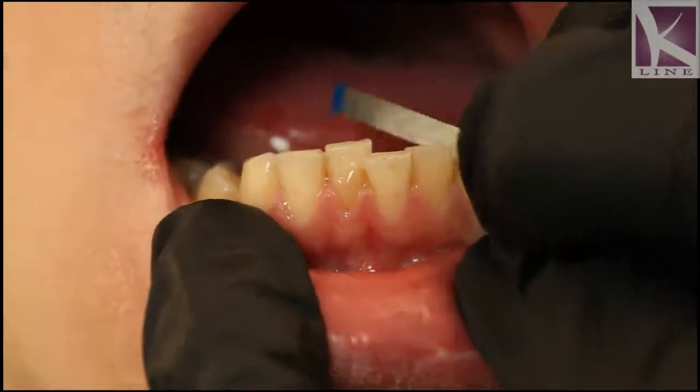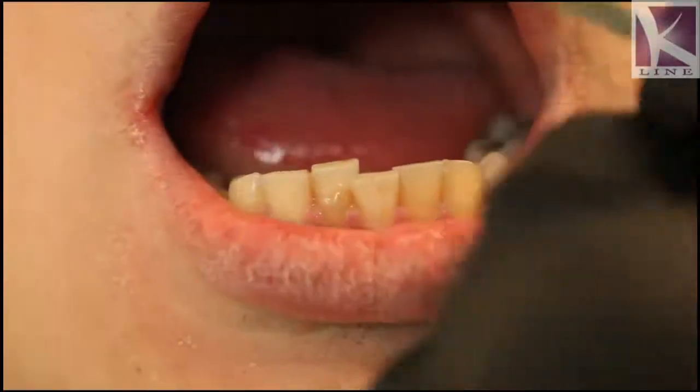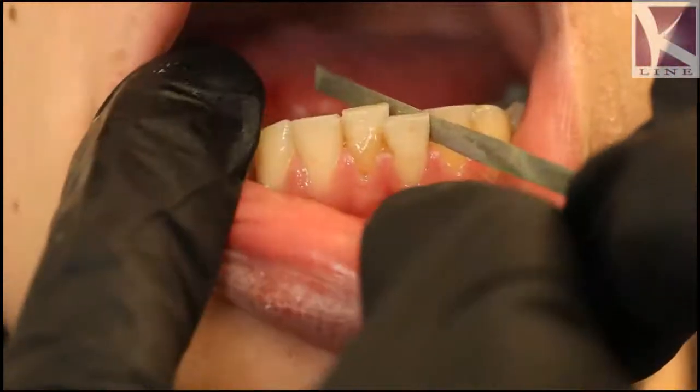I tend usually to go in one direction only, as much as possible, which is only the labial side. And then when I create enough space I have to go back and forth, labial and lingual, in order to ensure that there is enough space.